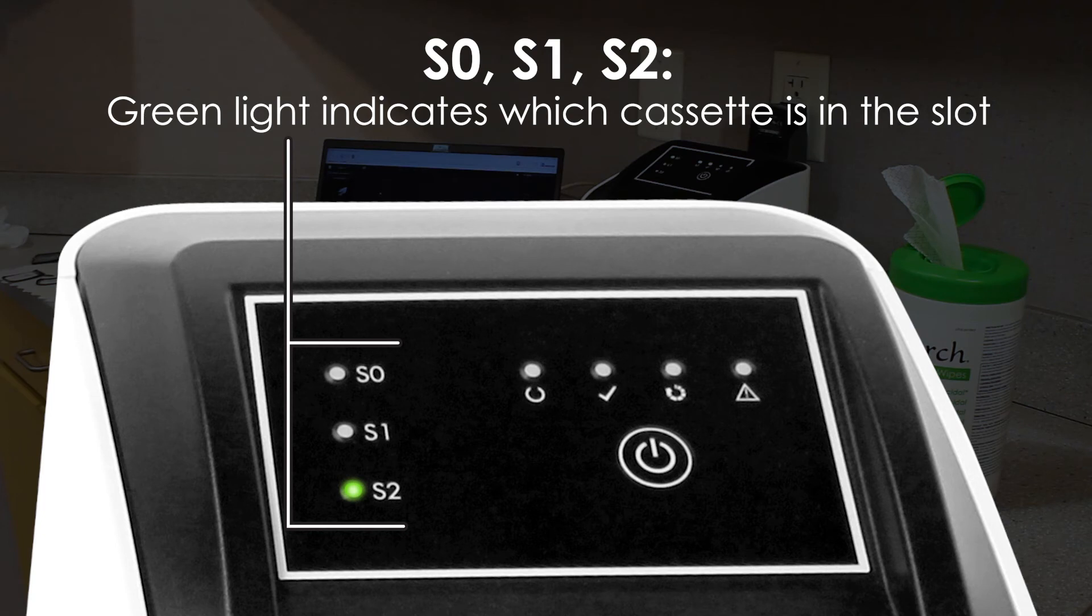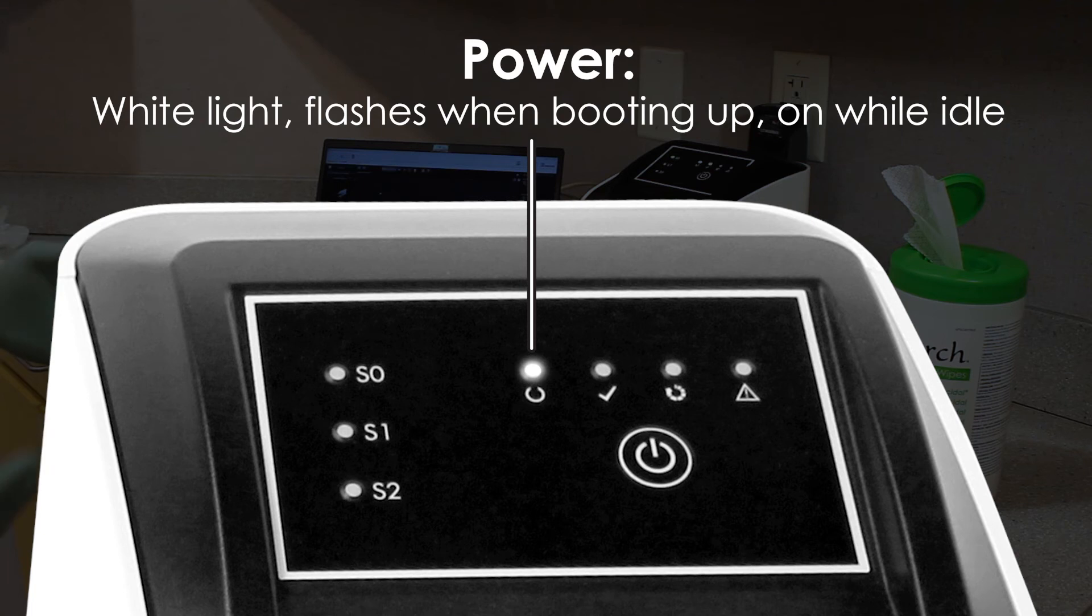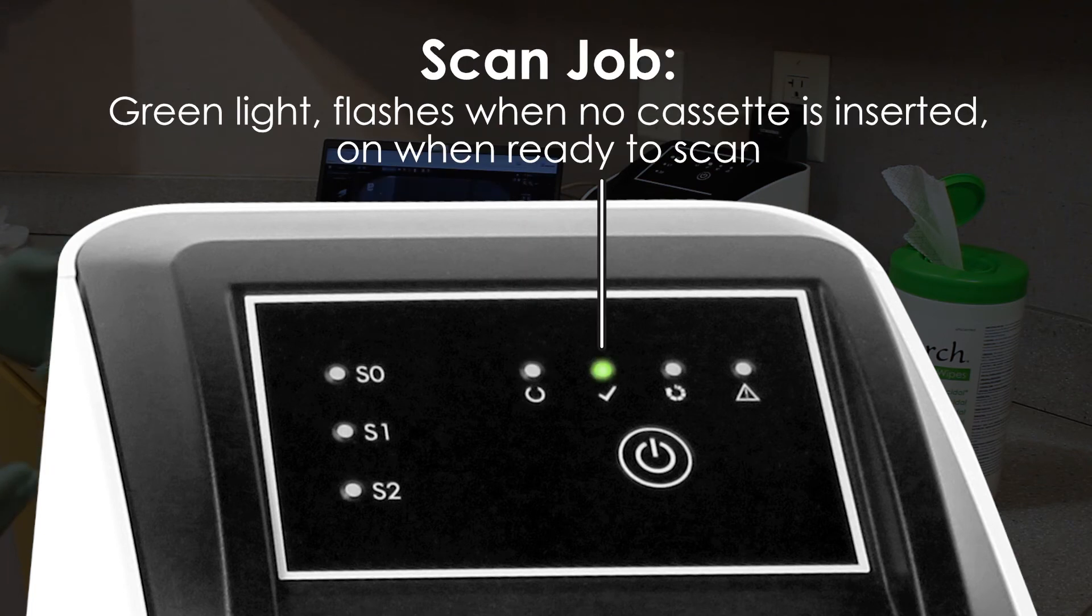The cassette indicators noted with S0, S1 and S2 will illuminate green depending on which size cassette we have inserted. The power status indicator will flash upon boot up and illuminate a solid white upon idle. The scan job indicator noted with a check mark will illuminate green when the system is ready to accept the scan job from the imaging software.